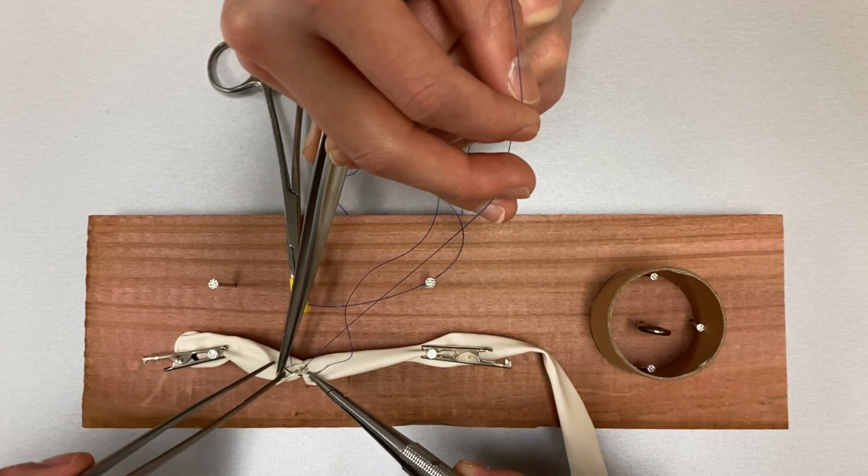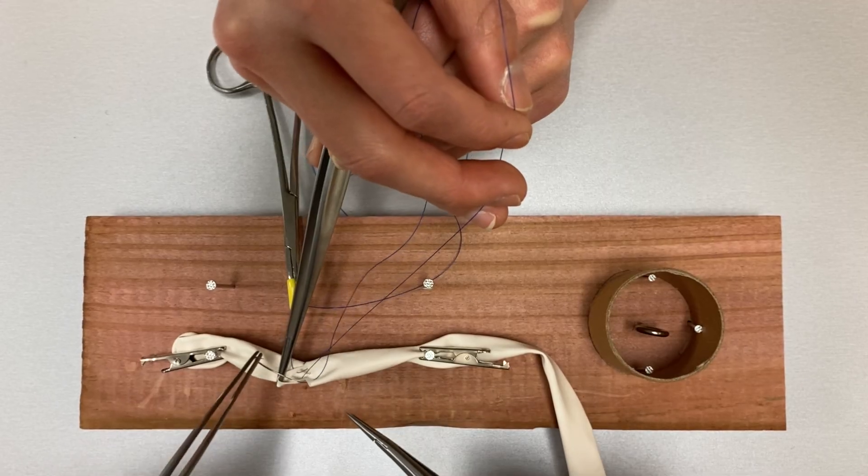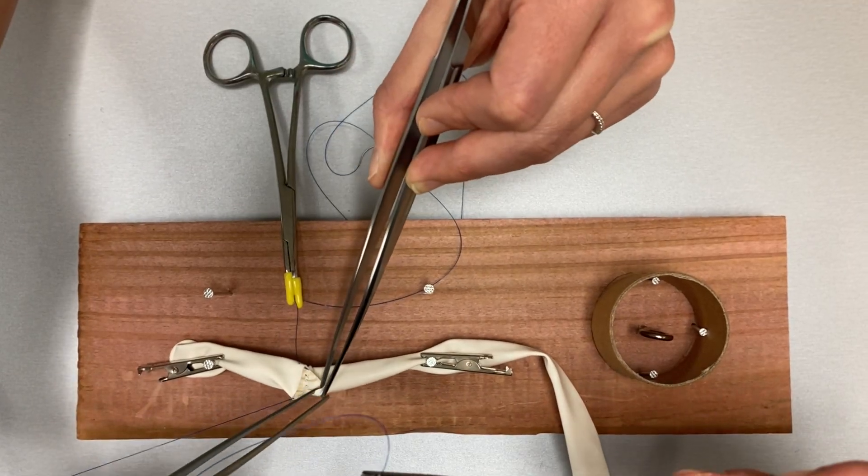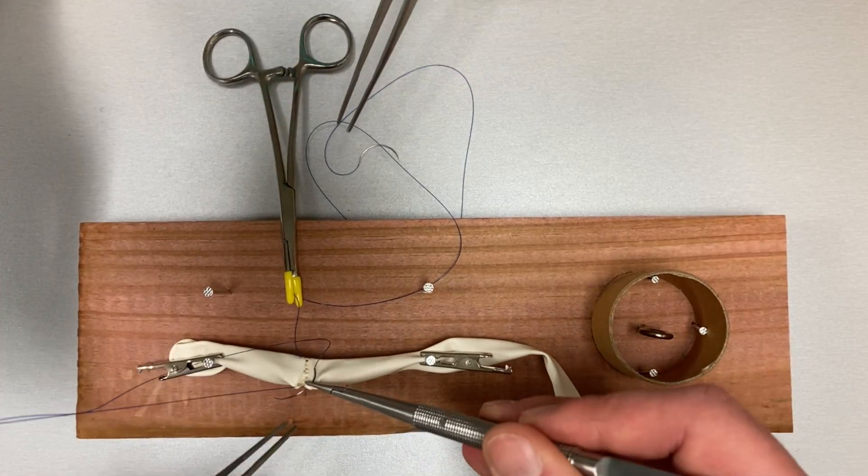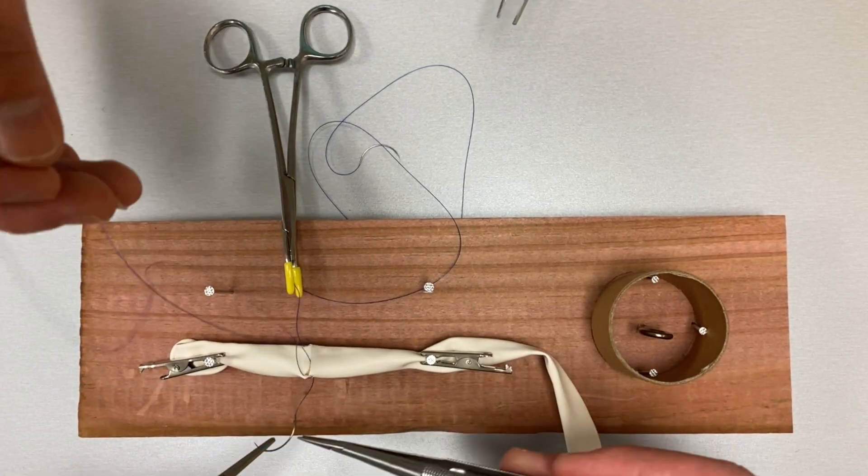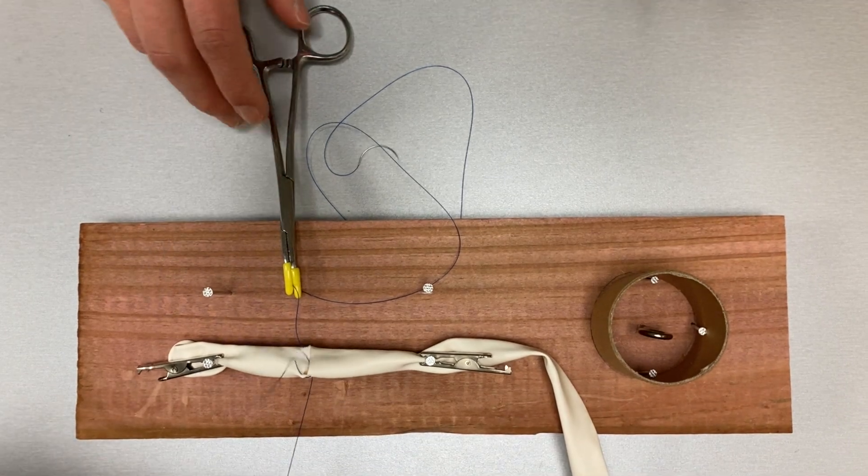As you approach the 9 o'clock position of the left vessel, sewing towards yourself will become difficult. When this occurs, take a final bite from inside to outside and shod the working end of the suture.